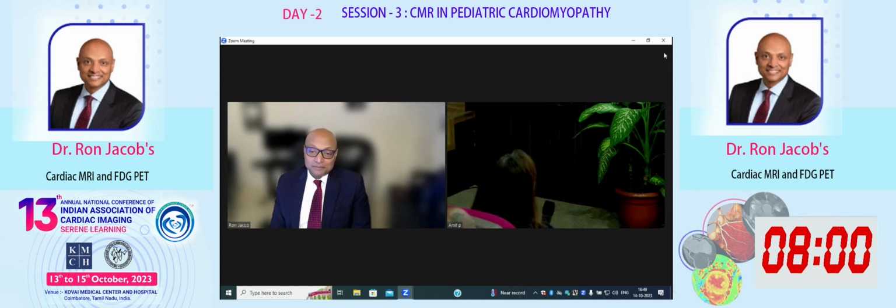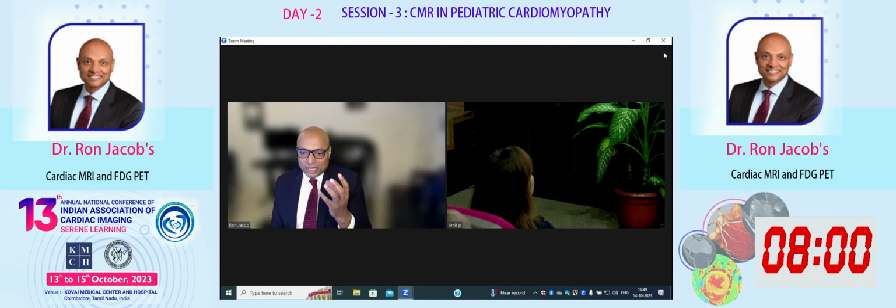That's a great question, Vanessa. CMR will give you everything as a baseline. However, for follow-up after immunosuppressives, the PET gives you certain quantitative markers that I don't think are as mature in CMR. We do a max SUV, and there are vagaries with that, whether you follow the max SUV or a total SUV amount of inflamed mass, but I find it probably qualitatively easier to do by PET.